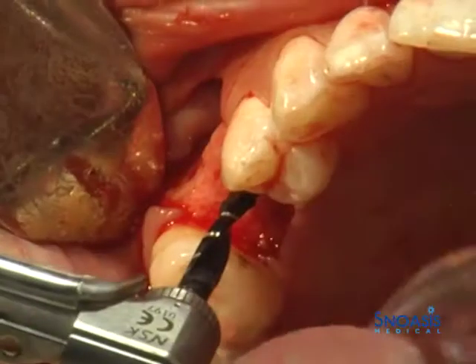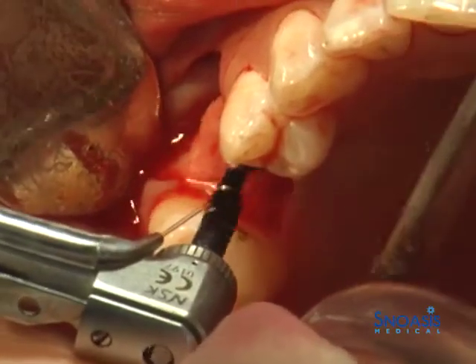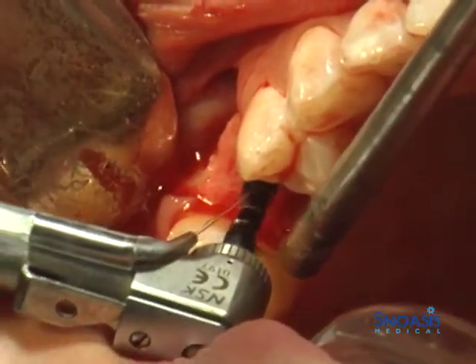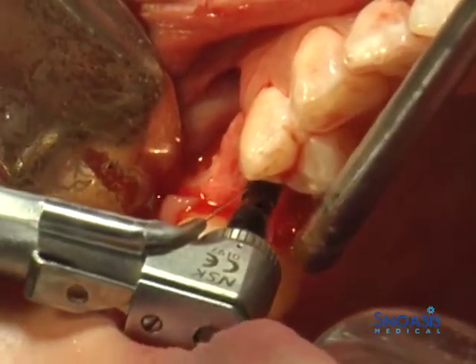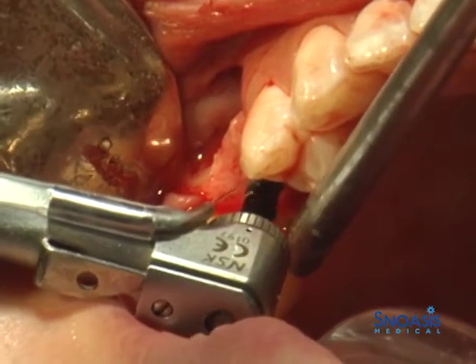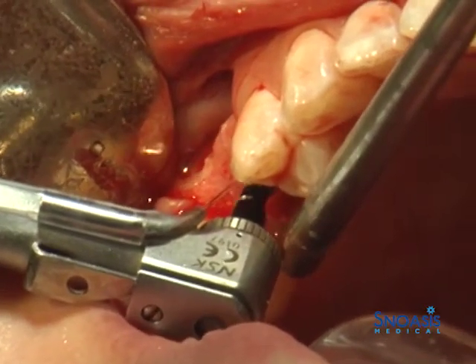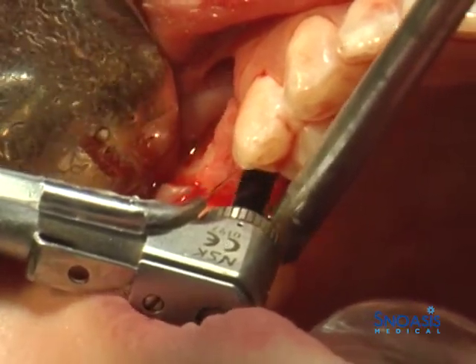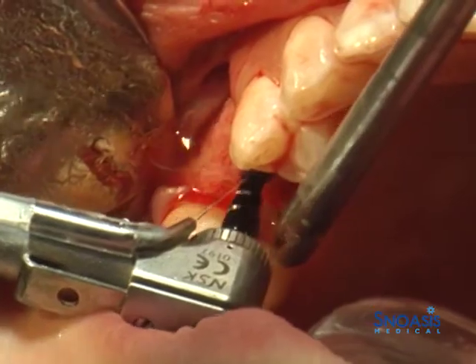A Nobel Active Implant protocol is used for initial drilling of the implant osteotomy, up to the diameter just prior to the final diameter drill for implant placement.